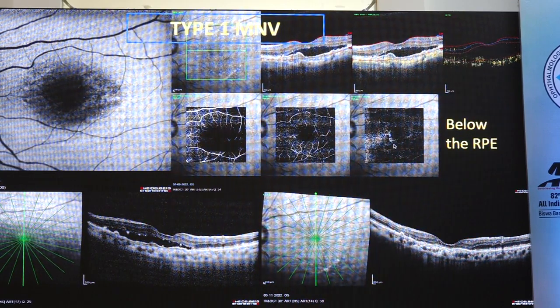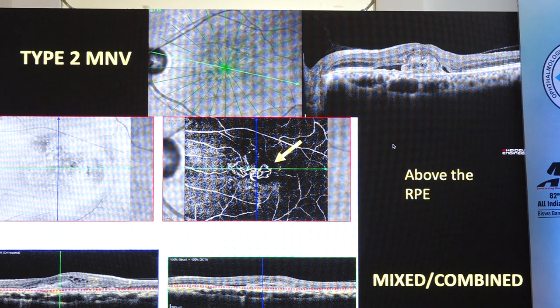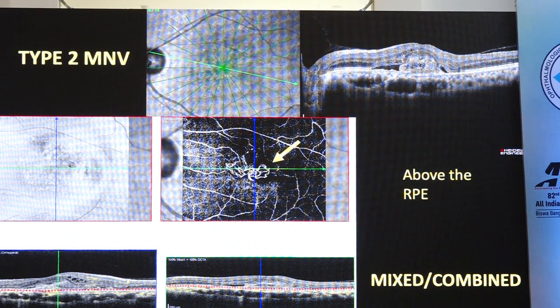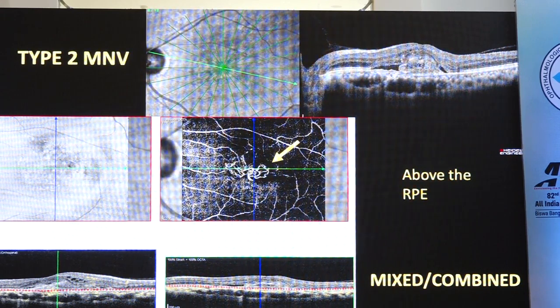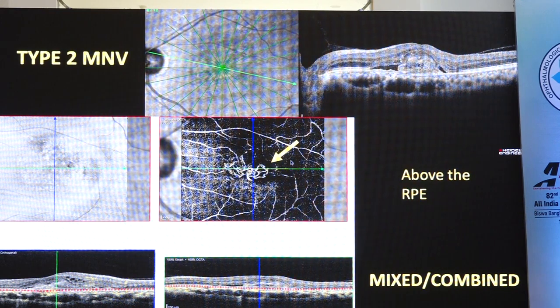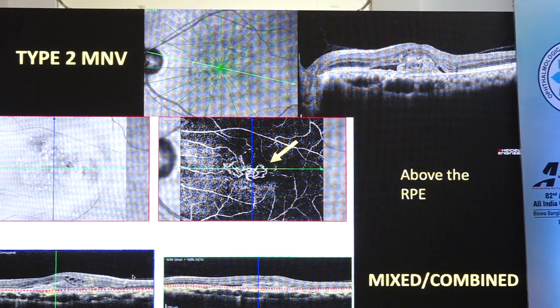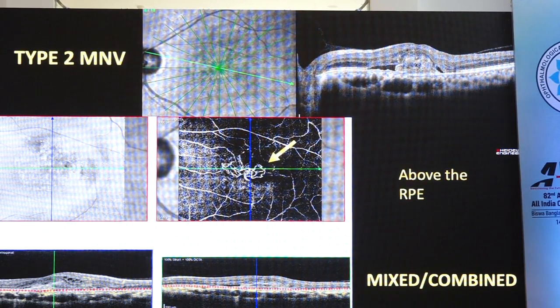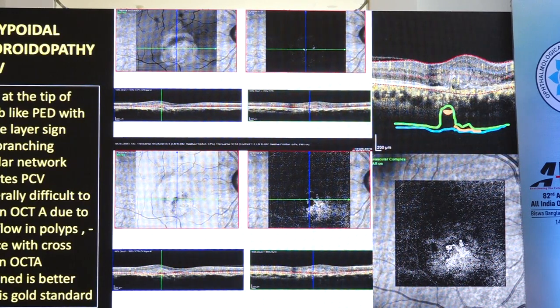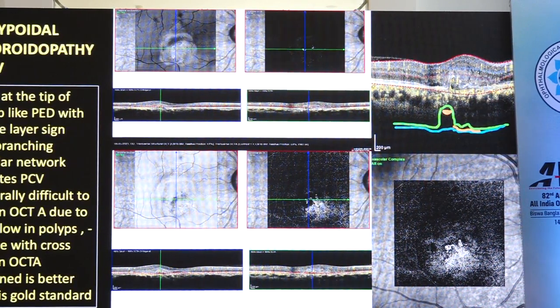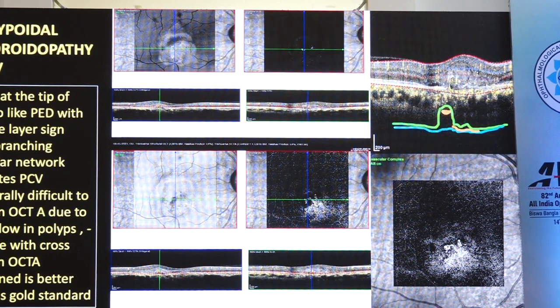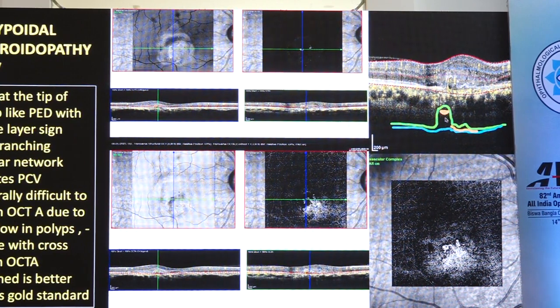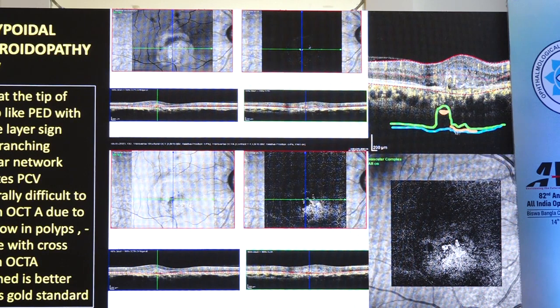This is a type 2 macular neovascularization where you see the neovascularization above the RPE, which can be better located when you assess the cross-section flow simultaneously with the en-face images. Macular neovascularization can be combined or mixed also. Polypoidal choroidopathy or PCV can also be detected on OCT angiography — you can detect the flow in the thumb-like polyp lesion and also the branching network in the double layer sign.